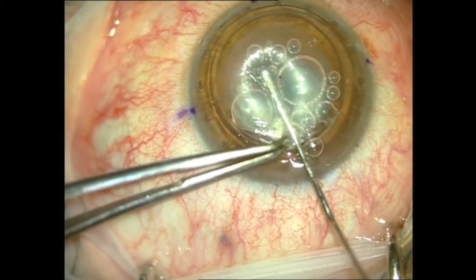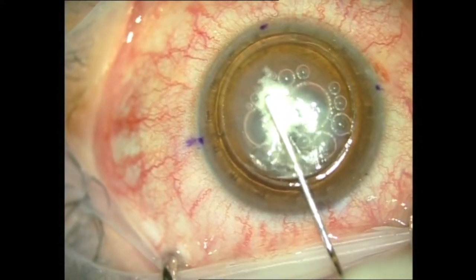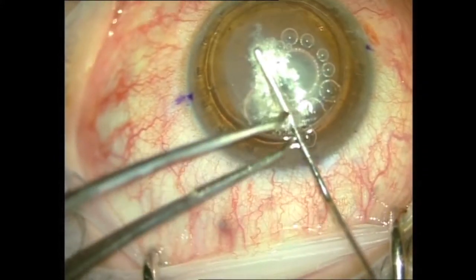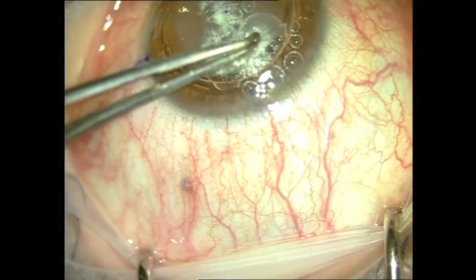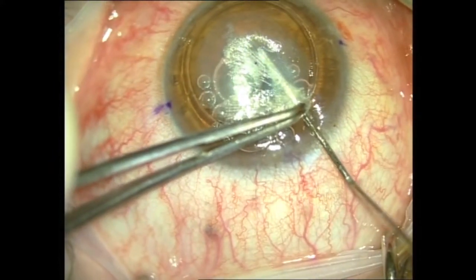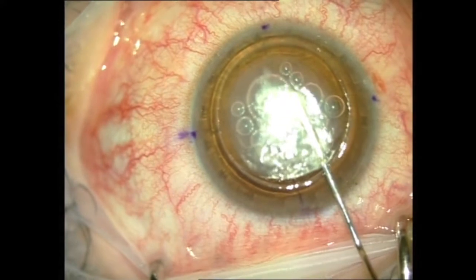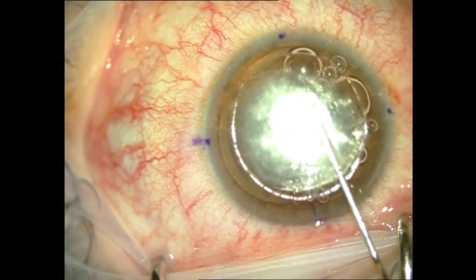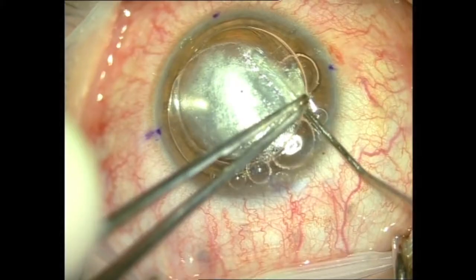In this case, the first air injection resulted in just stromal whitening without the formation of any bubble. So I decided to reintroduce the cannula in another location. At this time, injection of air resulted in the formation of a type 2 bubble, evident by the clear margin and reaching the periphery of the cornea.